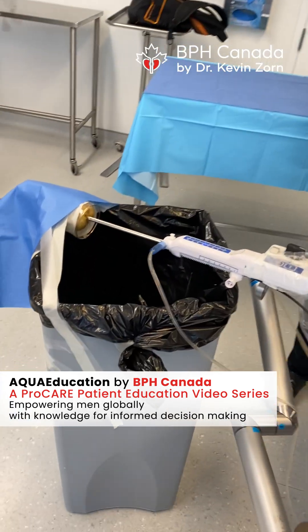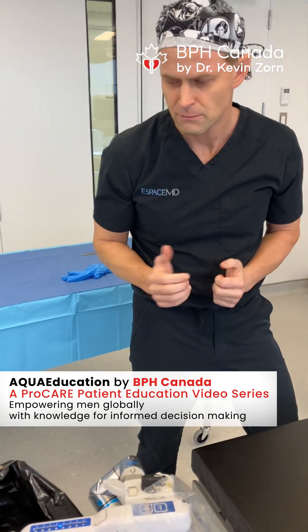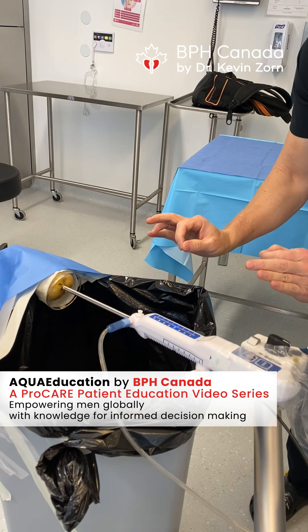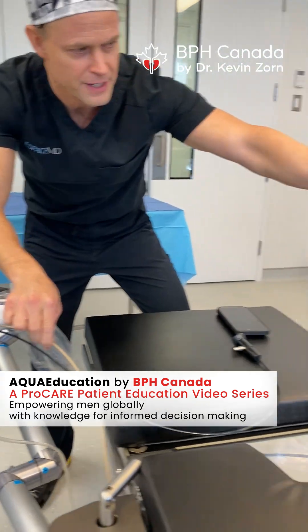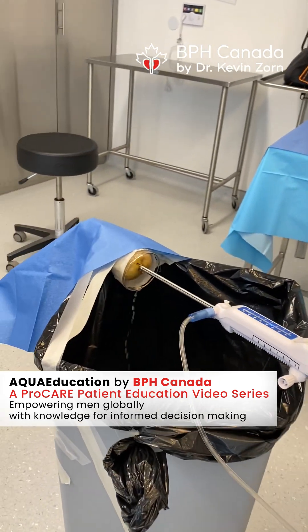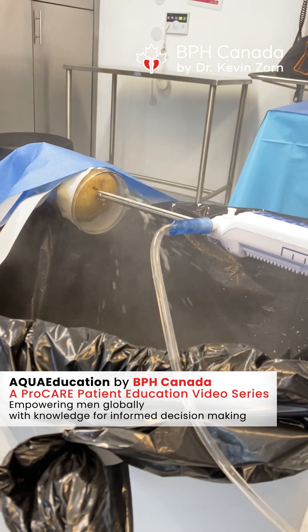So this is what we're doing to that position. And if we're not happy, we can use these buttons to increase or lower the intensity of power. Or if I'm not happy, I let go, I adjust, we continue. You can see there's not much to see because it's motionless — the only thing pulling back is a beam of water being pushed through at over 8,000 PSI through our pump. That's connected at the base of the console. You can see how powerful it's coming back now. Our angle of sweep is 225 degrees — kind of like three-quarters of a pizza — and it's pushing so hard that we're getting up to that level, coming back to about 2 centimeters away from the edge of our camera.